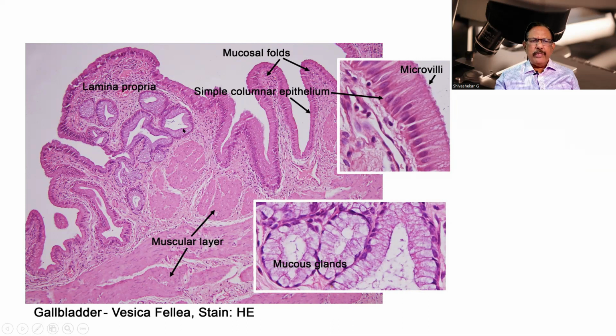And these are all the mucous glands that are there. And look at this mucous gland. It is showing some inroads into the underlying tissue. So this is again the mucous gland. Columnar cells or goblet cells. Low down, I'm able to see the nuclei. Thanks to this reference.